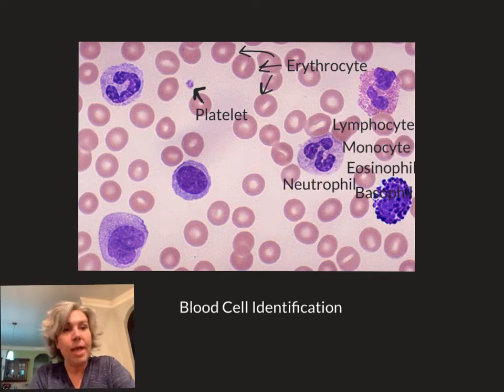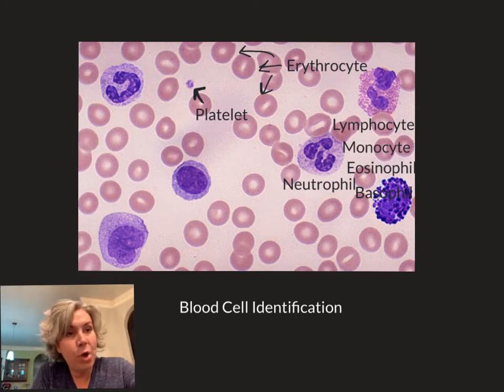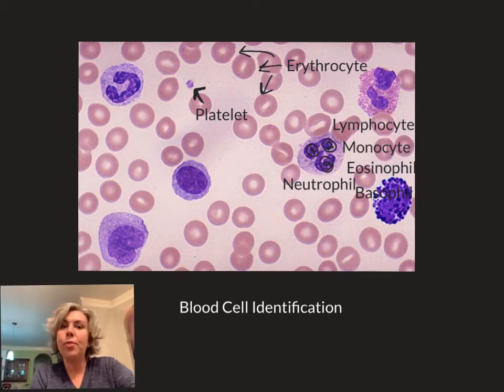And if you look, that is a good solid 3 lobes. I'm going to just draw to point out these lobes. Here's a lobe. I'm going to put a number 1 right here. Here's a lobe, put a 2 there. And then here's a lobe right here. So 3 lobes of nuclei are in that cell, and that tells me it's a neutrophil.